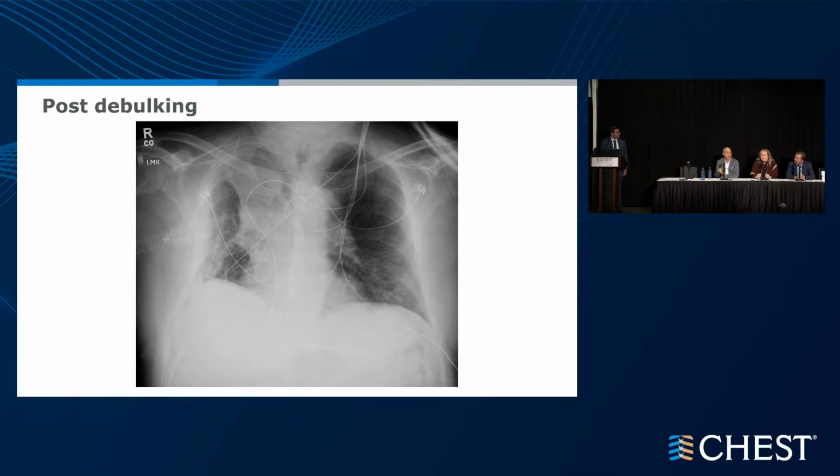But I think, again, if you're concerned about a patient being lost to follow-up, then I'd be more concerned about a stent in the airway without proper, good management of the stent, because that becomes obstructing. It can be mucophilic, and it can be a problem too. So there's both sides of that. I said the same thing. Yeah, okay.